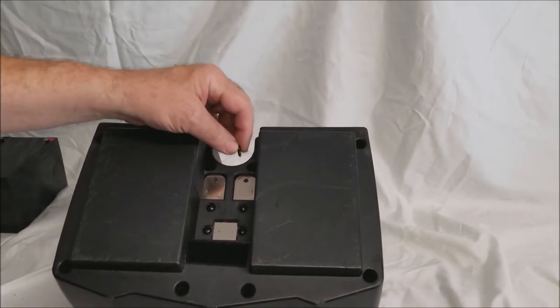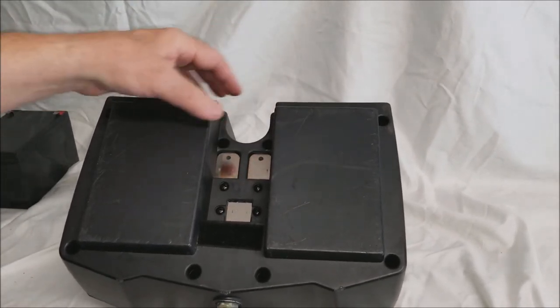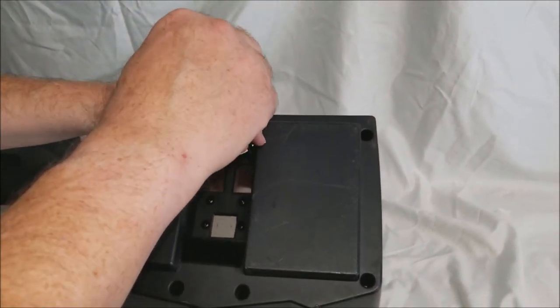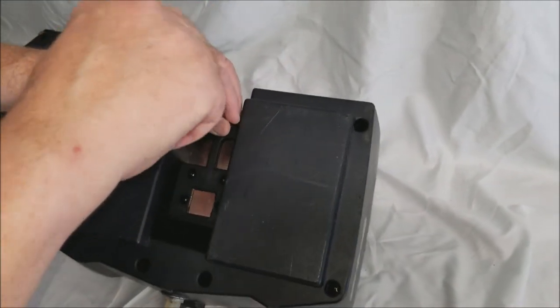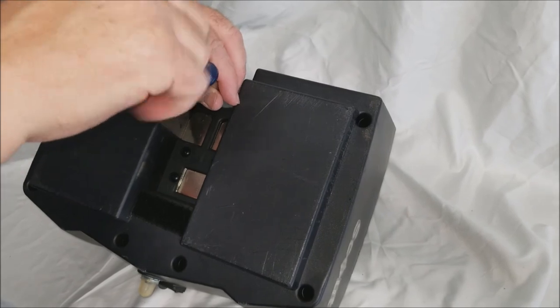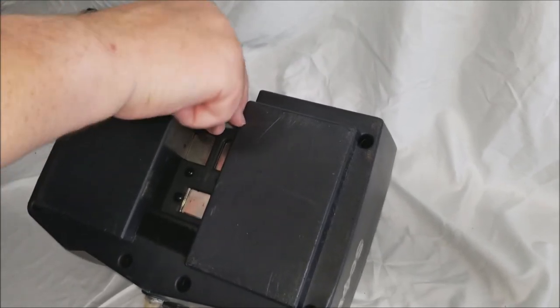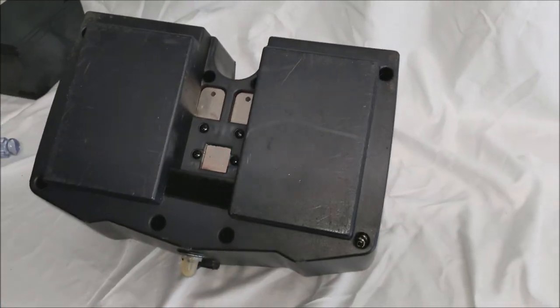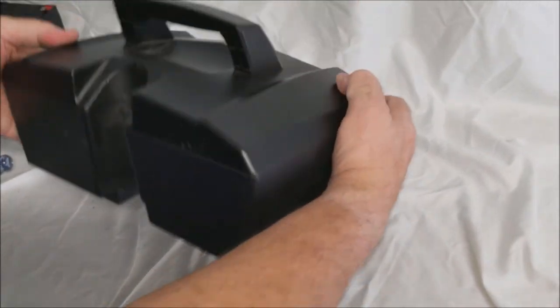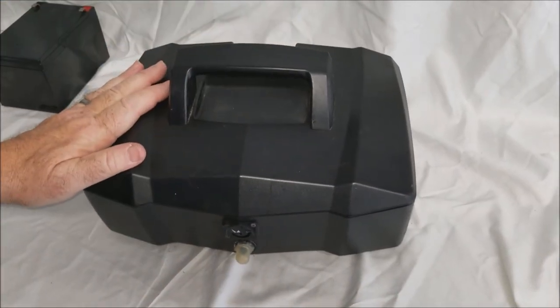We're going to put the last screw in, and by the way, regardless of the style of battery pack, you can just drop that screw right in the hole and pick it up with your screwdriver. You don't want to over-tighten these screws. Check the others to make sure they're tight. And you've just changed out the batteries in your scooter battery pack. It's ready to go.